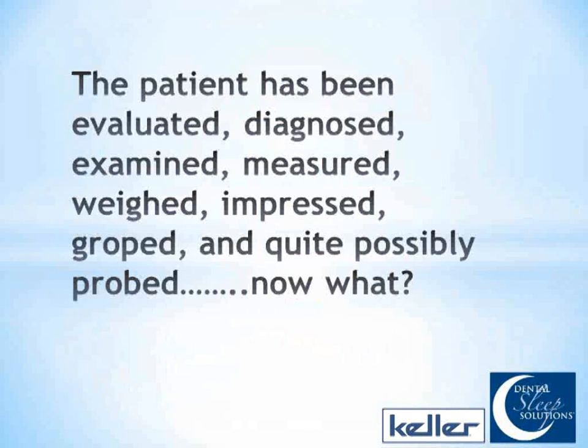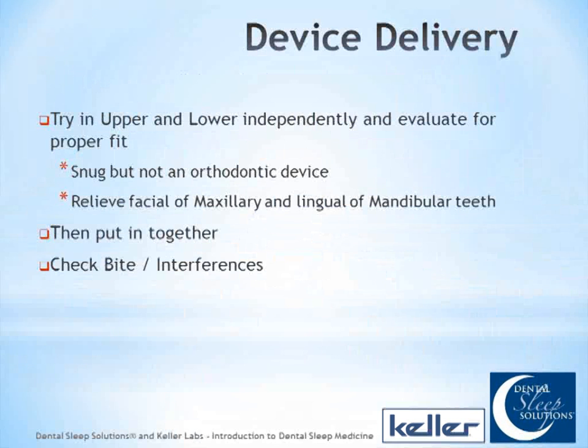Well, we've come a long way in the last 4 series. So basically, by the time we've gotten here, the patient's been evaluated, diagnosed, examined, measured, weighed, impressed, groped, and quite possibly even probed. Now what are we going to do? So, we're at the point where we're going to get started with the treatment and taking the impressions, and now the patient's going to start wearing their appliance. So at the delivery, how does that work?